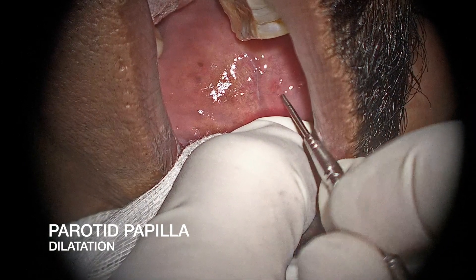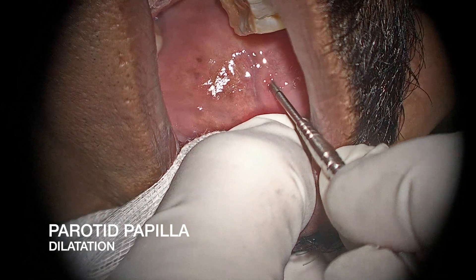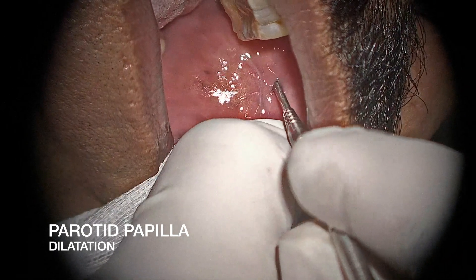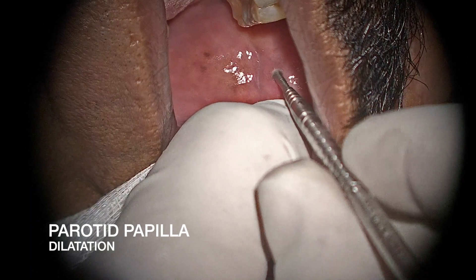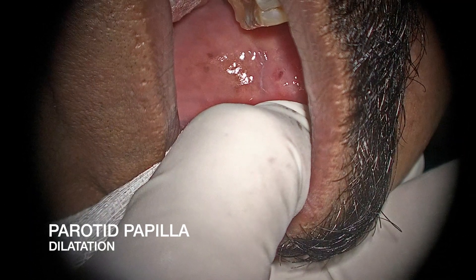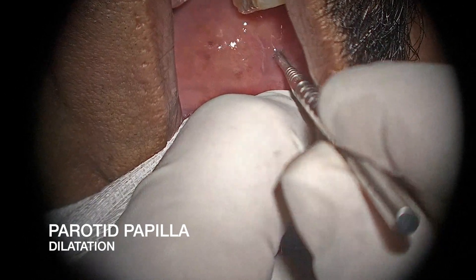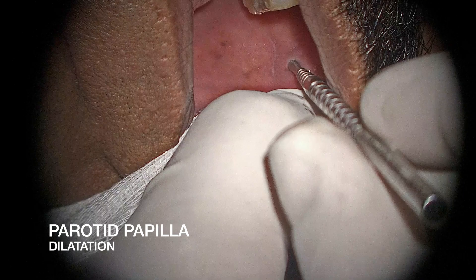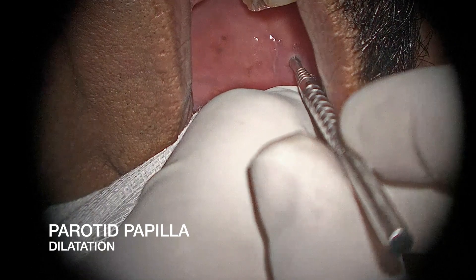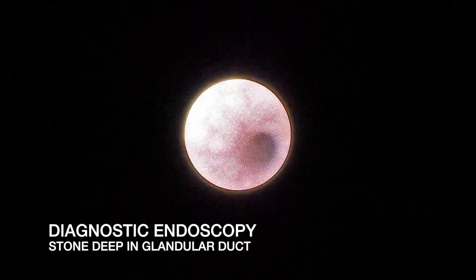This patient came to us with recurrent episodes of left side parotitis and we proceeded with a sialendoscopic approach. The first and crucial step to any sialendoscopy procedure is to atraumatically dilate the papilla, or the opening of the parotid duct. We use sequentially larger diameter dilators to accommodate entry of at least a 1.3 mm scope.